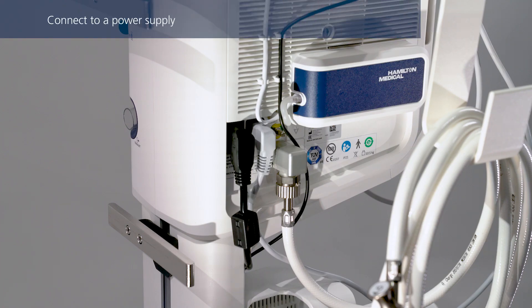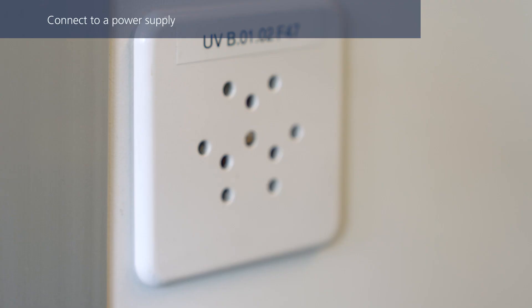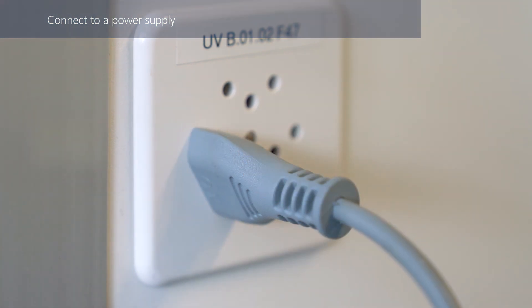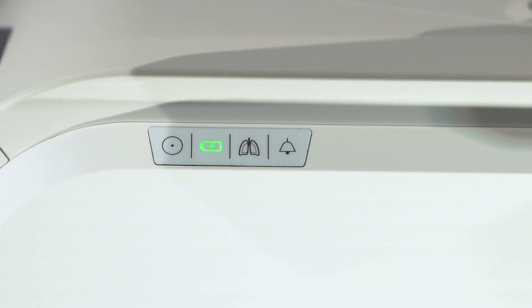Make sure the power cable is firmly connected in the socket to prevent accidental disconnection, and then connect it to the primary power outlet. The battery status indicator shows the charge status of the battery, even when the ventilator is turned off. When the indicator is solid green, the battery is fully charged and connected to primary power. When flashing, it means the battery is still charging. If the battery is not charging for whatever reason, the indicator will remain dark.